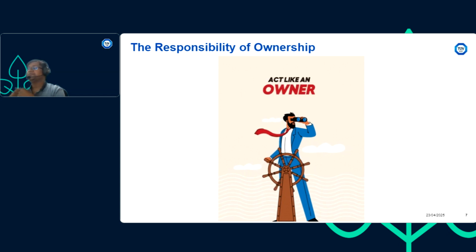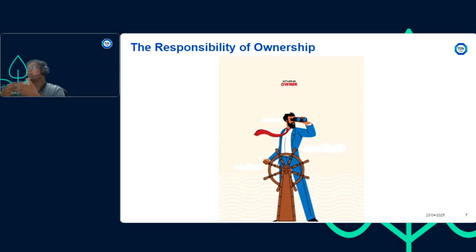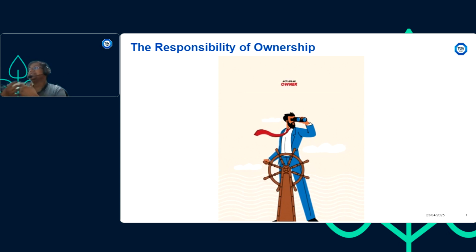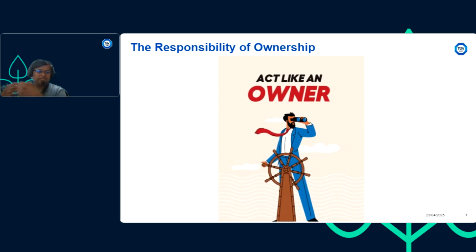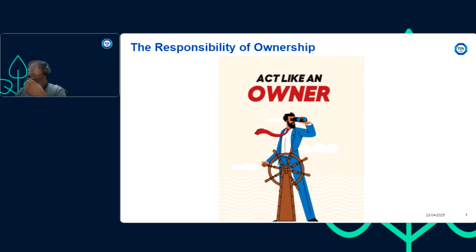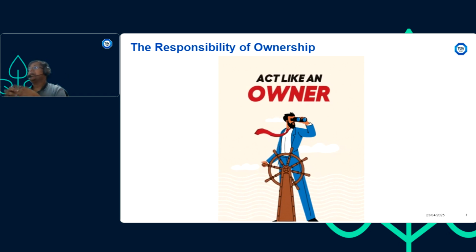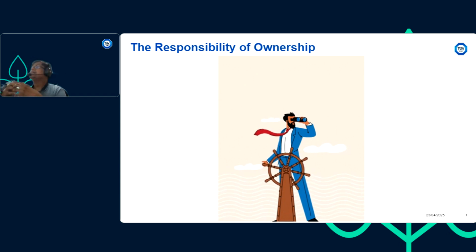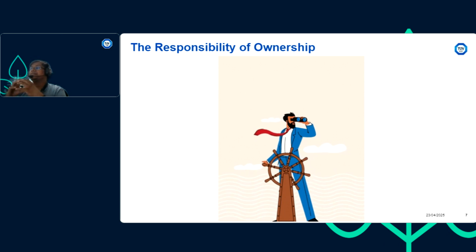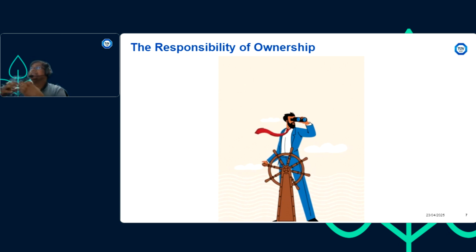And if we are very active and attentive about security from the starting stage itself, like from the design phase of the software, it will be very easy during the life cycle of the product to maintain the security. And considering that in context, the ownership of security is with everyone. Okay, so why am I saying this?